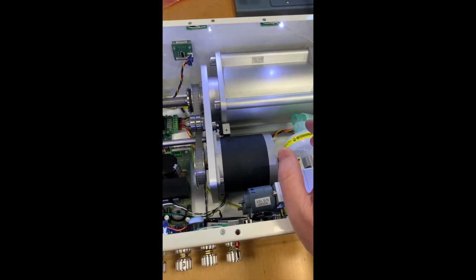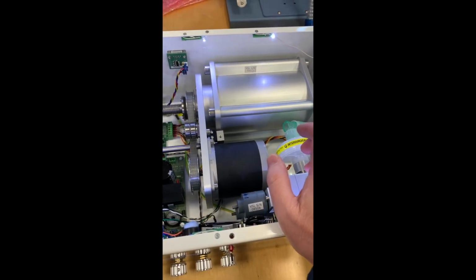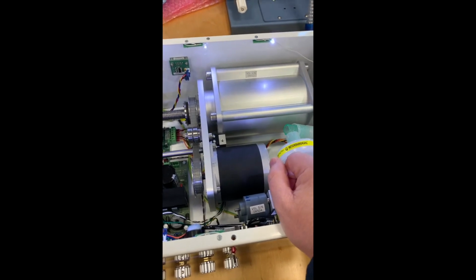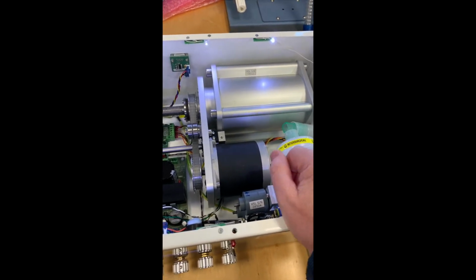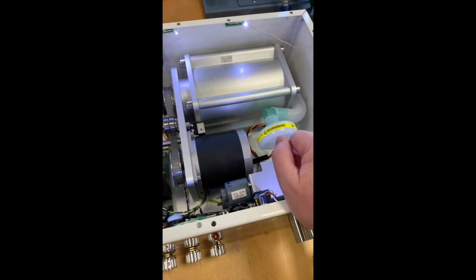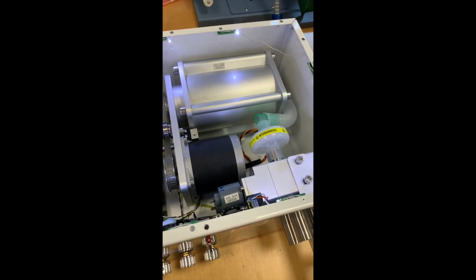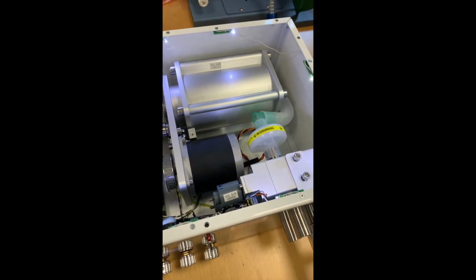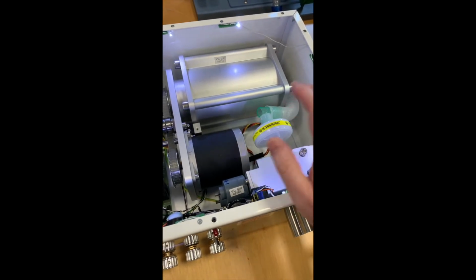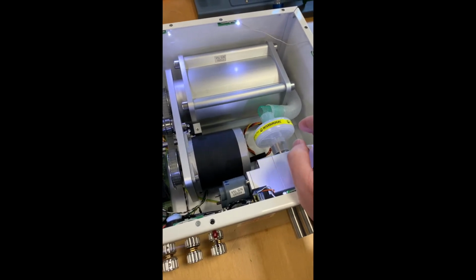All the parts that are in contact with the patient are made of either stainless steel, anodized aluminium or silicon, so the whole machine can be readily disinfected for decontamination between different patients. There's a viral and bacterial filter here which protects the chamber from contamination. In the event of contamination or use in patients with known transmissible respiratory infections, the whole machine can easily be disinfected, and this viral filter and communicating pipes can be discarded, replaced with new, and the machine quickly returned to use. The whole procedure to do that takes about 30 to 45 minutes.